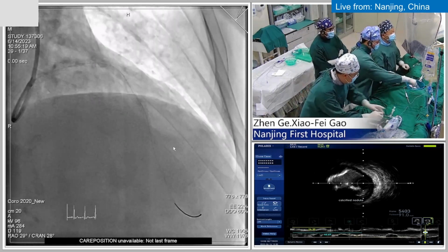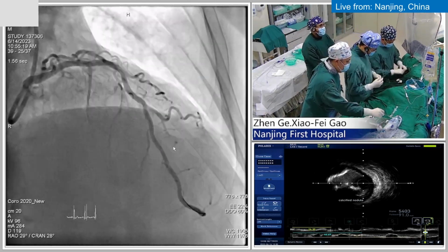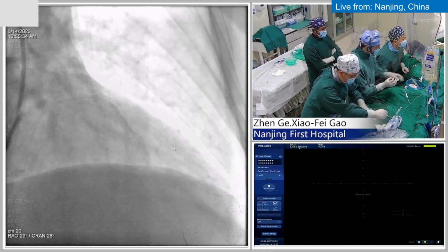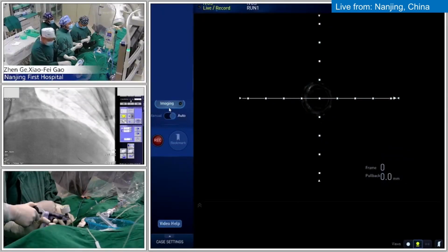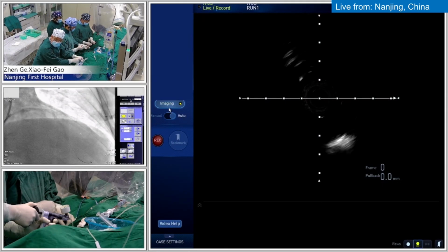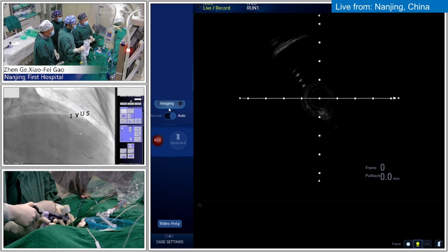Okay, so that was the question which somebody has asked. We'll give you the answer with IVUS. So how much is the volume of PCI in China at the moment? Is it already the world's biggest or catching up soon? You mean my center? No, the Chinese country. Well, the country, more than 1 million.